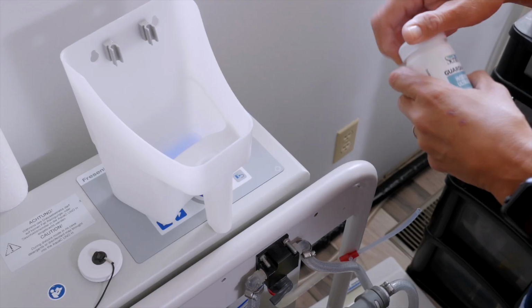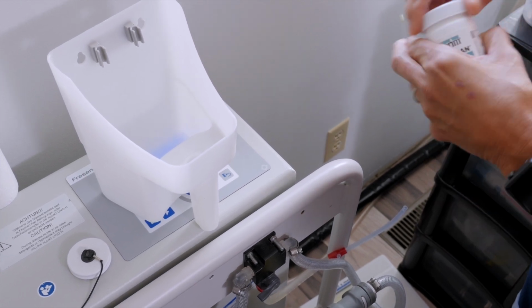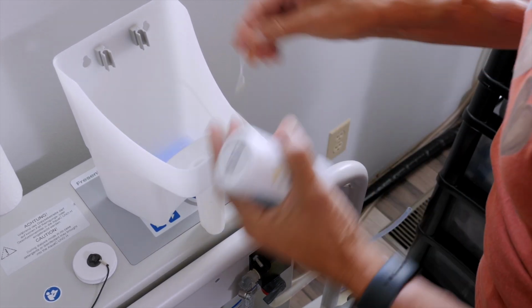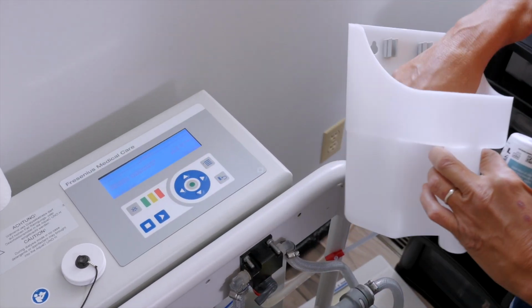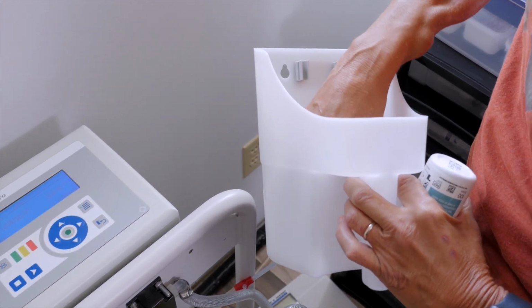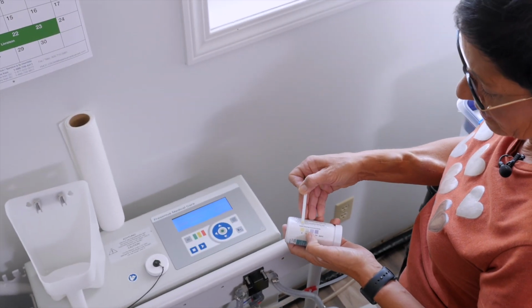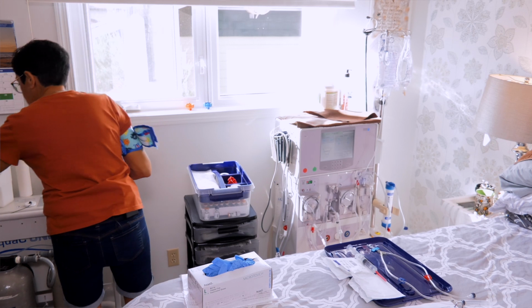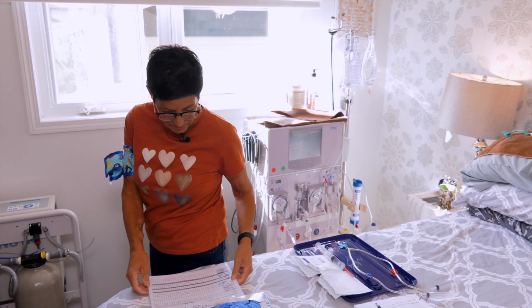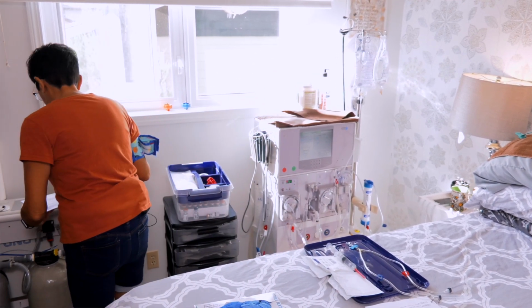And then I also check for chlorine. Again, it should come back the same color as it goes in. And you got to do it for 30 seconds. And again, it's come back same as it went in. So it's good too. And if they were not good, you would not be able to do treatment. You would have to call your technician and get things figured out.